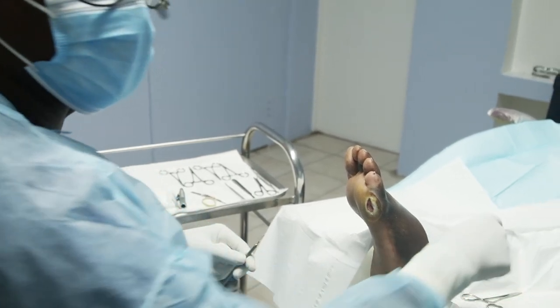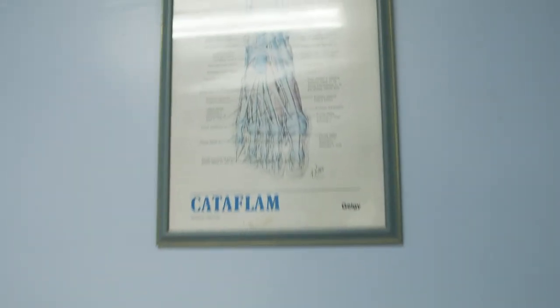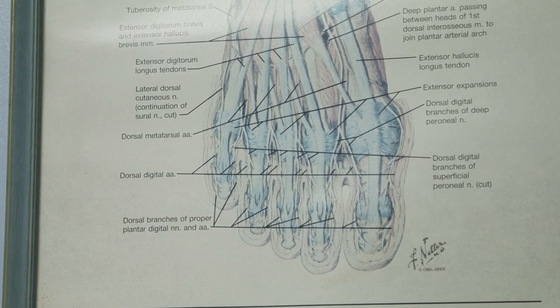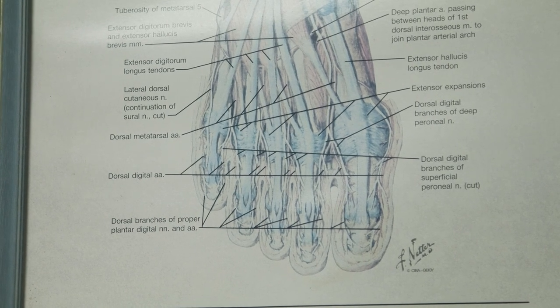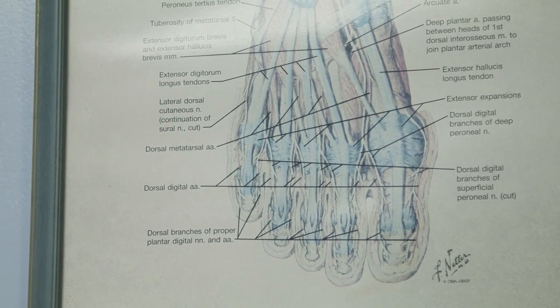It's really interesting work. If you take a look at that picture there, we're going in the middle. See the blue parts of the joints that come around? We're going in the middle of that capsule, just from the left side of the fifth toe coming right in. We're going to slide across the bone, lift the head of the metatarsal up and come out of the joint. Here we go.